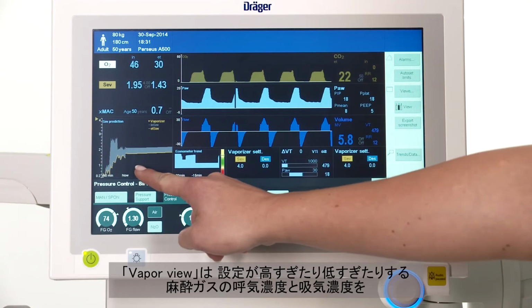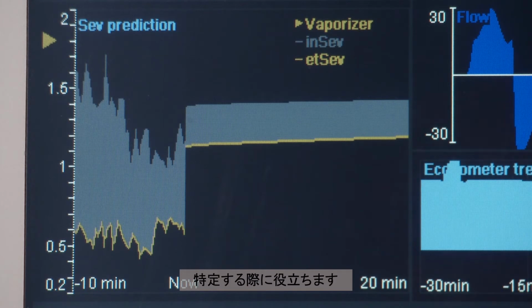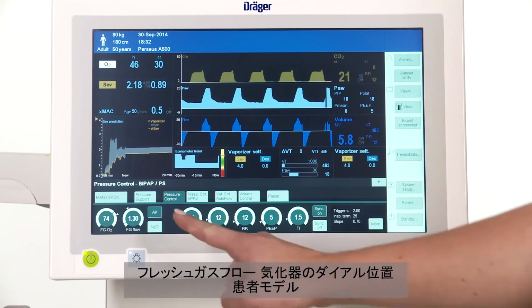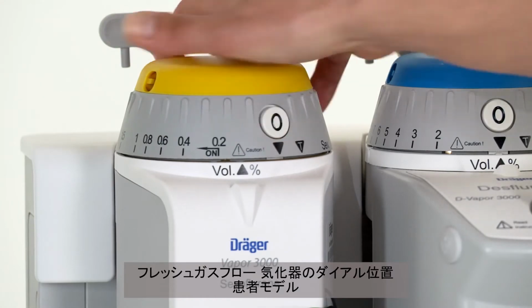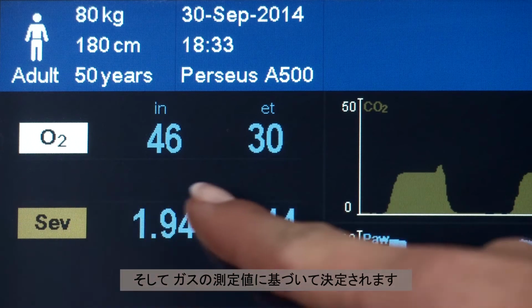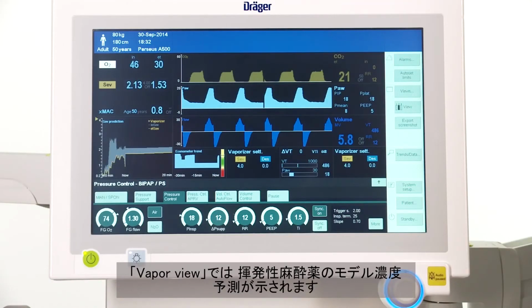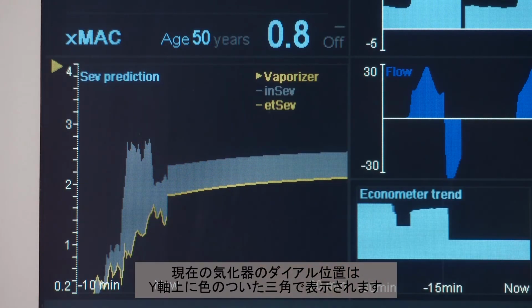Vapor View will assist you in identifying inspiratory and expiratory concentrations of anesthetic gases that were set too high or too low. The prediction of future anesthetic gas concentrations is based on the fresh gas flow, the position of the hand wheel of the vaporizer, a patient model, and the measured values of the gases. Vapor View provides you with a forecast of a modelled concentration of volatile anesthetic agents. The current position of the vaporizer hand wheel is indicated as a coloured triangle on the y-axis.